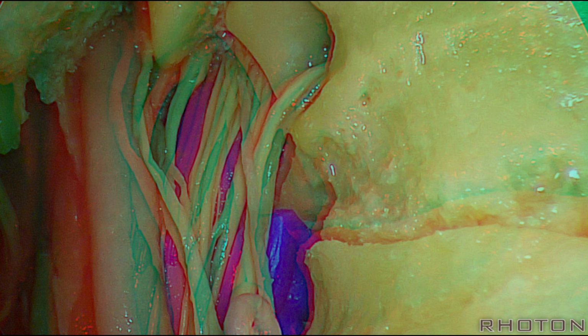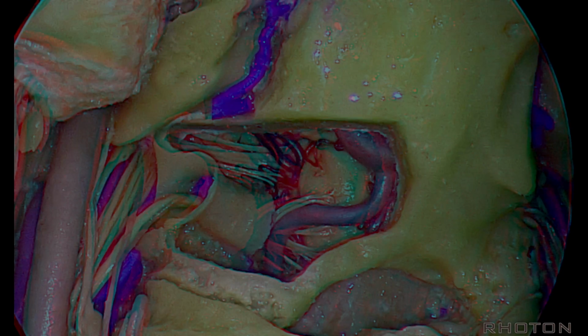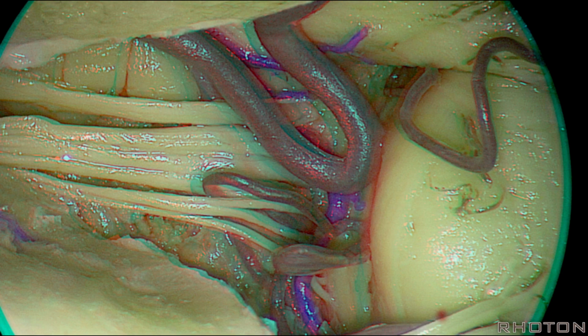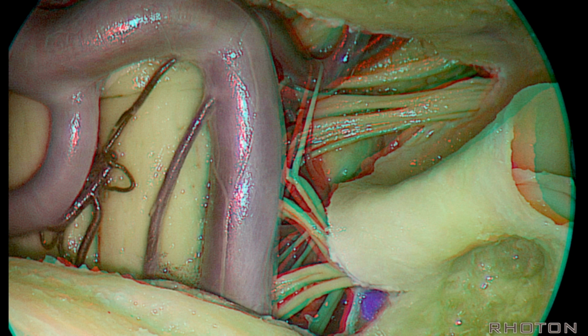Here's a view over to the hypoglossal canal and jugular foramen here at the lower end of the petroclival fissure. The view with the endoscope angle laterally, endoscopic view, an intradural approach, and then the opposite side, 9, 10, 11, and then the 12th nerve coming through the canal.